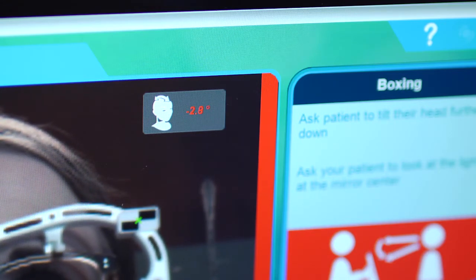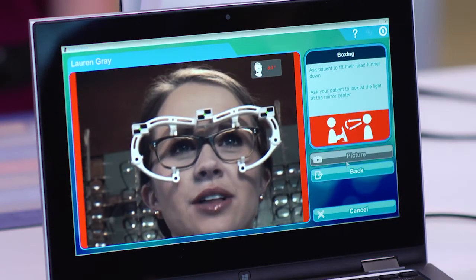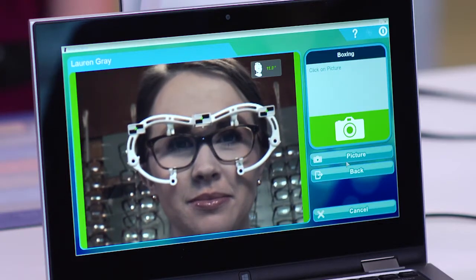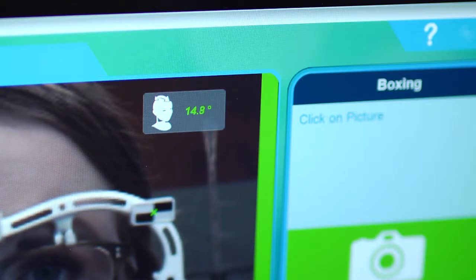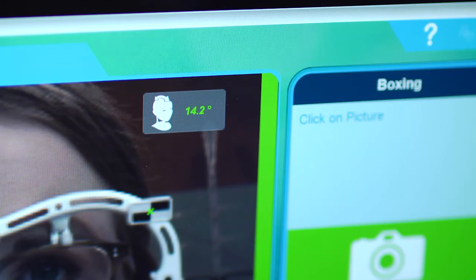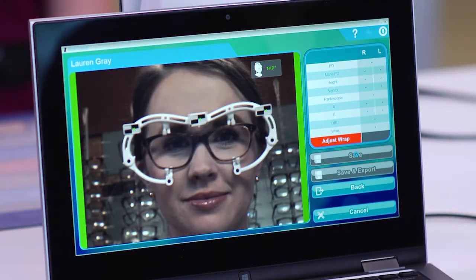The instructions for taking the second picture will then appear. If the device, the patient, or the frame and clip move between the first and second picture, delete the first picture and start over. Lauren, I'm going to ask you now to lower your chin and focus on the light in the mirror. Ask the patient to lower her chin and focus on the light. The area displayed in the upper right corner of the screen should confirm that the patient has lowered her head by 10 to 20 degrees. Once you have the desired tilt, ask the patient to focus on that point. Taking care not to move the equipment, click on the picture or camera icon to take the second picture.